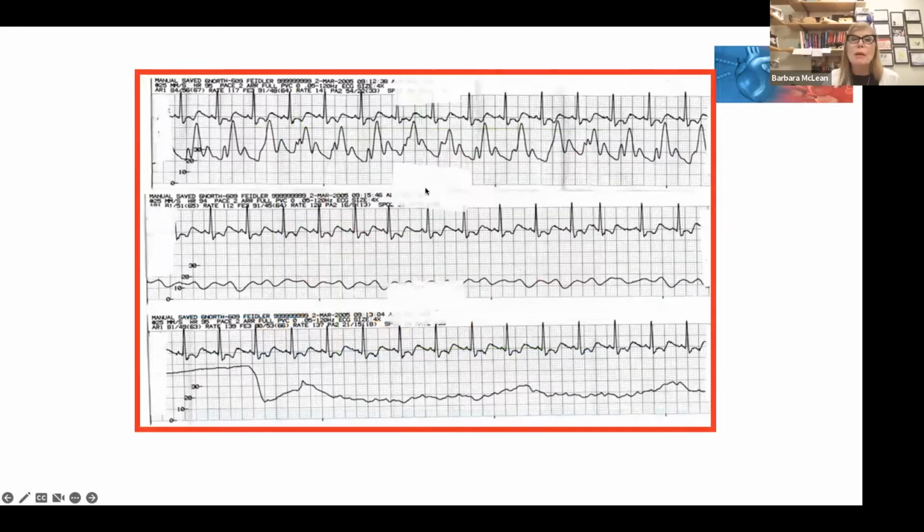Okay, so here's a patient with a PA catheter. He has some unusual things on there, which we just don't have time to talk about, and it's okay. But I've inflated the balloon. So here's his PA pressure, which is around 50/20. And then I inflate the balloon. The catheter sails forward into an occlusion position, and I am now reading the wedge pressure at around 15. Okay, so my wedge pressure is lower than my PAD, which is 20. My wedge pressure is around 15.